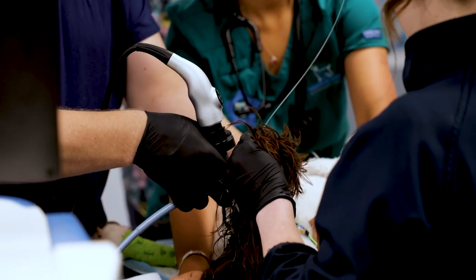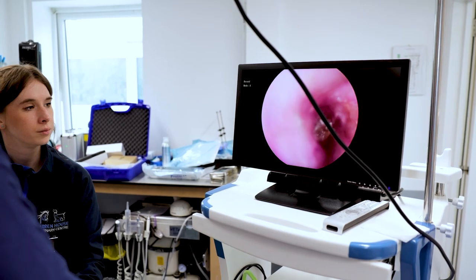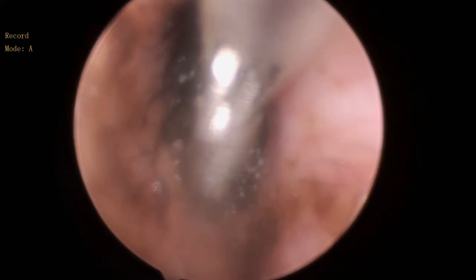Otoscopy, or video otoscopy, is when we pass a camera through into the ear canal to have a look at what's inside. That's linked with a cable to a screen and we can see easily what's happening in the ear on the screen, which means that it's magnified. We can also, through the same channel around the camera, pass instruments to remove whatever needs to be removed from the ear.